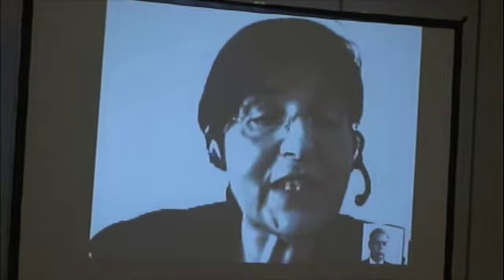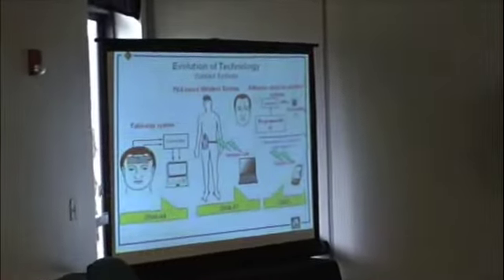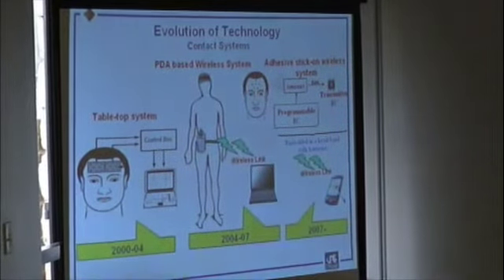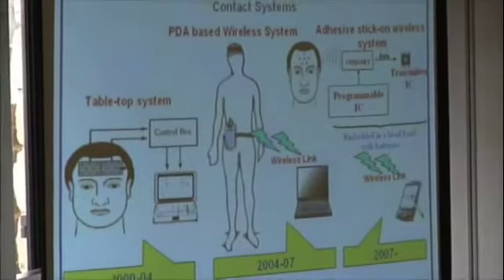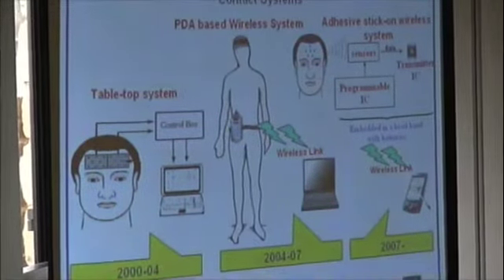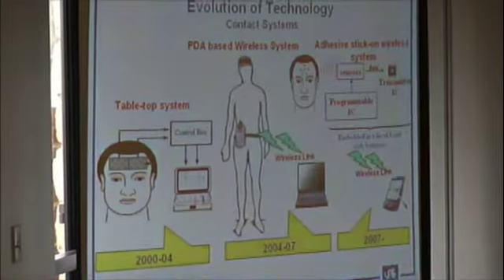If you move to slide 6, quickly move to slide 6, okay, you see the headpiece here, and you see also on our screen now the signal that is happening. The red thing is telling us that this part of our forehead is being oxygenated.